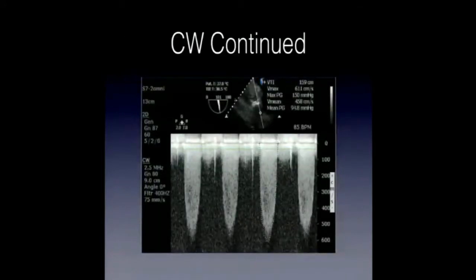I think I've added yet another slide. I wanted to illustrate that you can push freeze after you do this, and then you can pick trace.